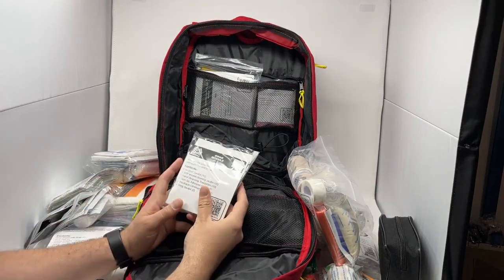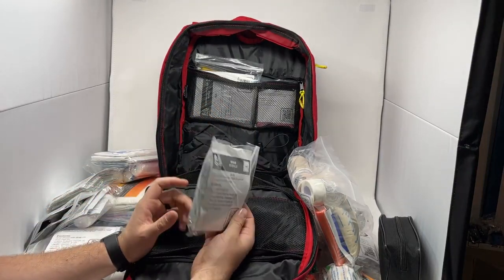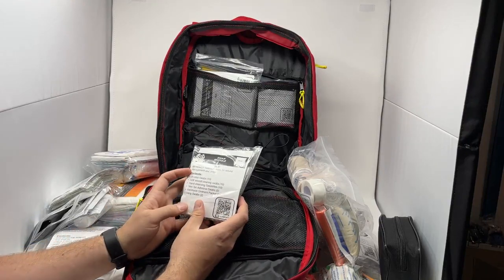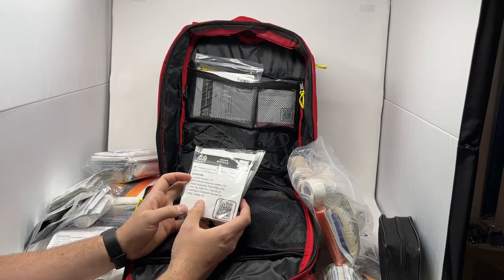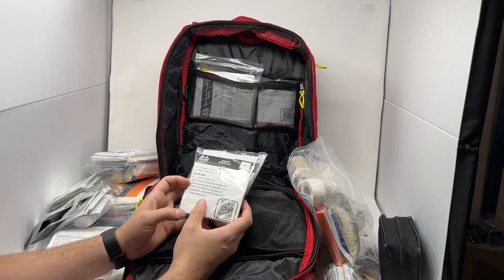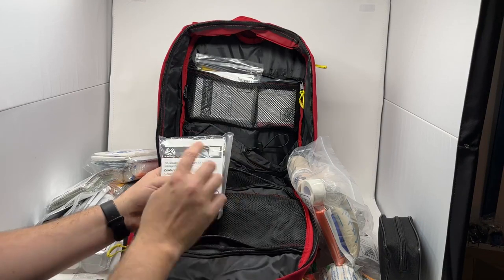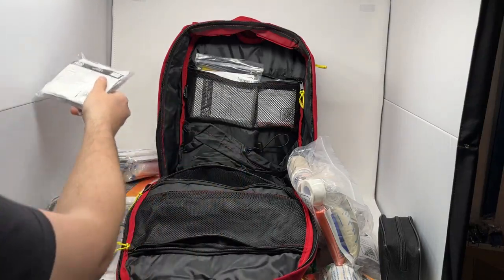Last but not least, we have our swab module — all the different cleaning swabs you can use for the patient. It includes 10 alcohol swabs, 10 BZK wound cleaning swabs, 10 hand cleansing towelettes, 2 skin tack adhesive swabs, 2 bacitracin ointment packets, and 2 sting swabs. Again, easily replaceable at wildmedkits.ca.